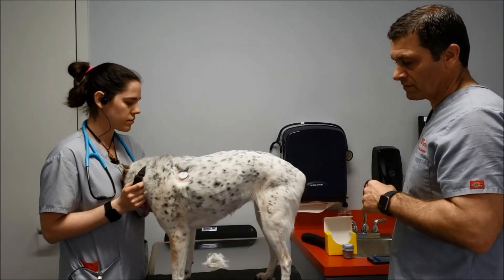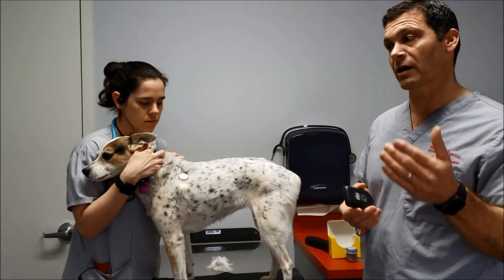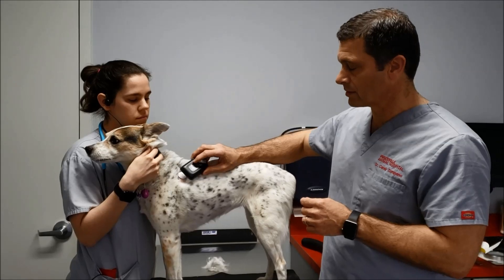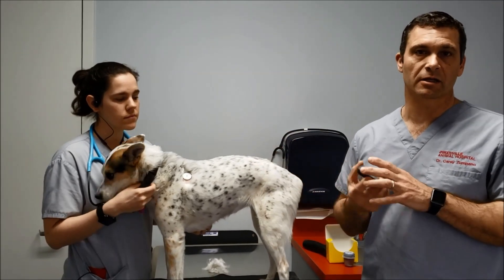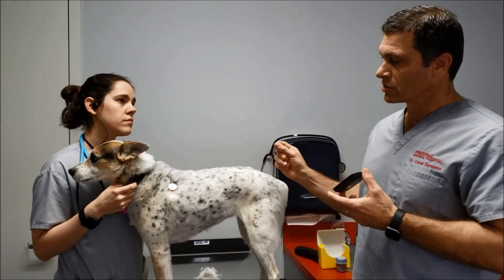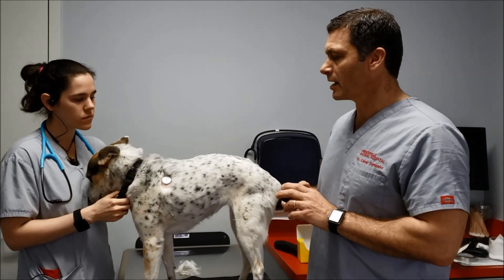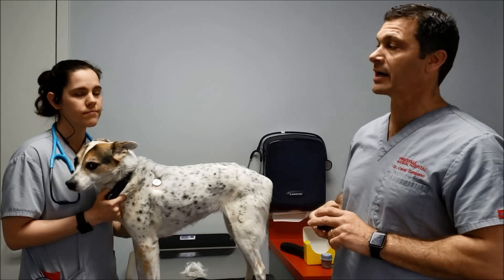Once you hit that two-week point, it's very easy to remove. You then get those two weeks of information to your vet, and we can look through it and try to make sense of the blood sugar patterns — where the highs and lows are, and how everything's working. The same applies with the manufacturer's reader — you just hold it up and get the same information. After two weeks Allison will return this to us and we'll download it into the computer and print out spreadsheets. We'll also have her make note of when insulin is given, the dose, activity level, feeding times, and whether the dog ate — all things we look at alongside the blood sugar data.